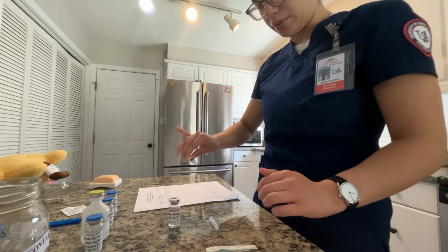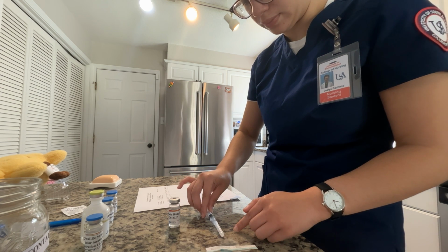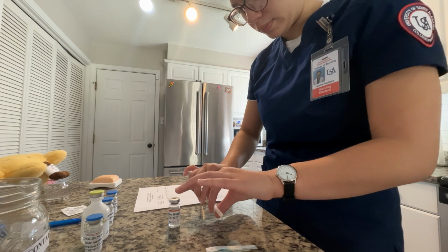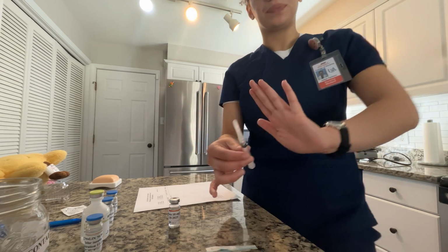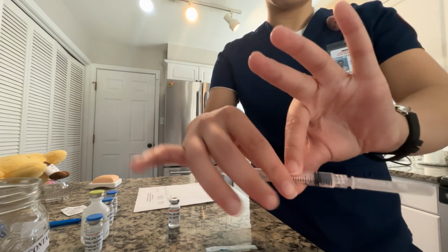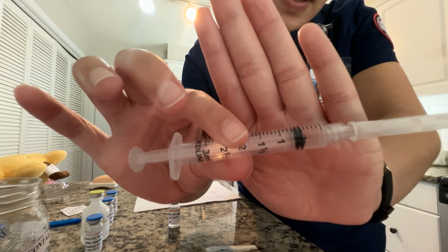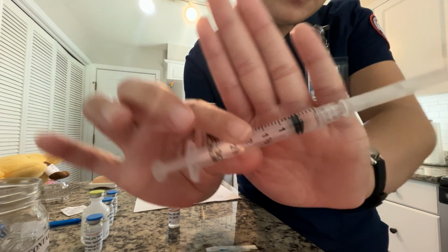And I'm going to scoop this. Okay. So here I have drawn up 0.5, or half a milliliter.